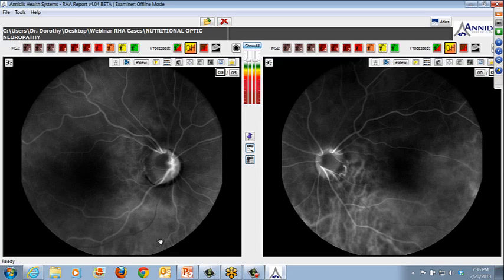So clearly she has some optic atrophy here. And this is a typical appearance you would get from someone who has chronic nutritional deficits. She actually had such a severe vitamin deficiency, I've referred her to a variety of people after that. She's actually doing much better. But, you know, this is irreparable damage to her optic nerves.